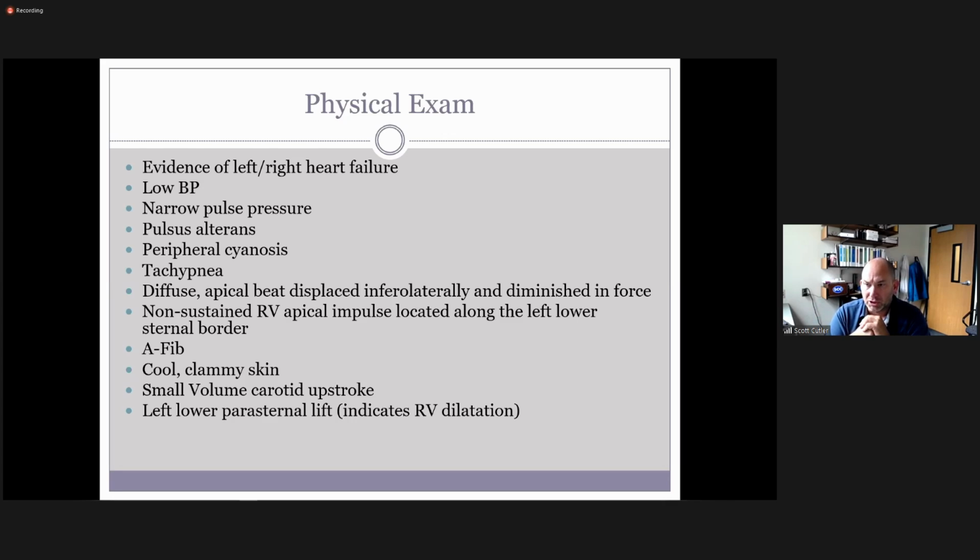The strain imaging, however, actually sees things that you don't see. As long as you have your system optimized pretty decently, the strain imaging package detects things that you actually can't visually see with your eye. It determines the real signal to noise ratio without the effects of gain getting in the way.